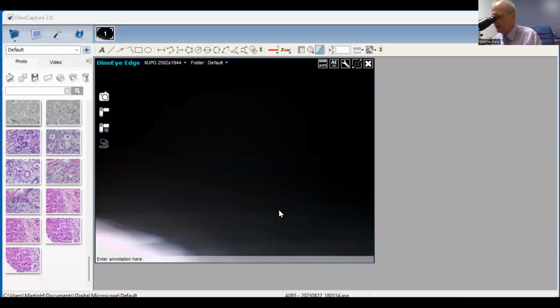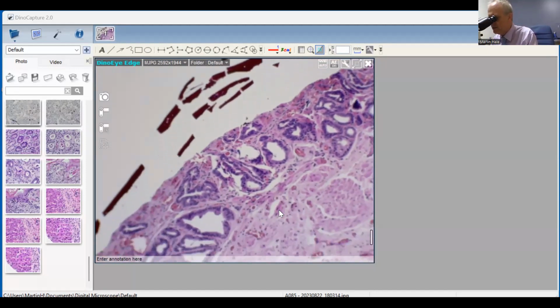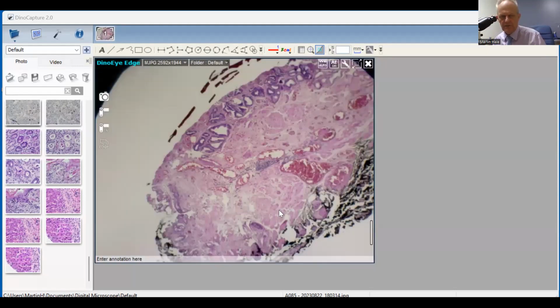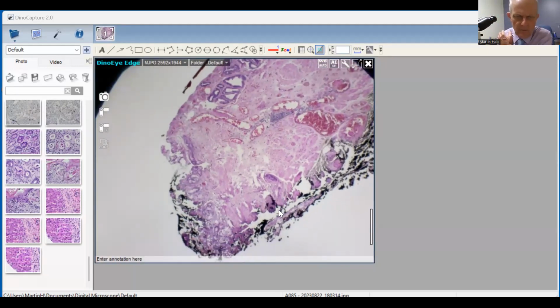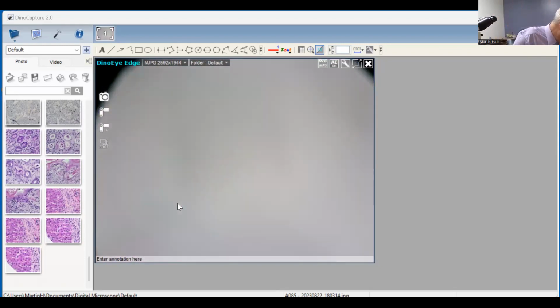And then notice the ink. So there's the red ink, so I know where it is. So it's close to the resection. But importantly, the actual resection margin itself. And Vikash is always very, what's the word, strict on saying is the actual margin involved. So here's the margin with the black ink. That's the deep margin, and the actual margin itself. These are dysplastic glands, but the margin itself is okay. So it's clear. And then last but not least, just to show you the tumor.